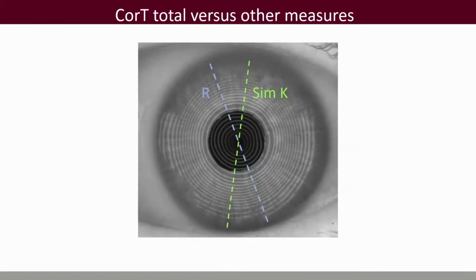And we have found, in fact, that if you use manifest refractive cylinder as the gold standard, in other words, that's the cylinder all the way from the front of the cornea to the perceptual component, in an ideal world, all the keratometries will always line up with a refractive cylinder, but in the real world, they're different. So how much different they are depends on how good a measure they are of the corneal astigmatism.